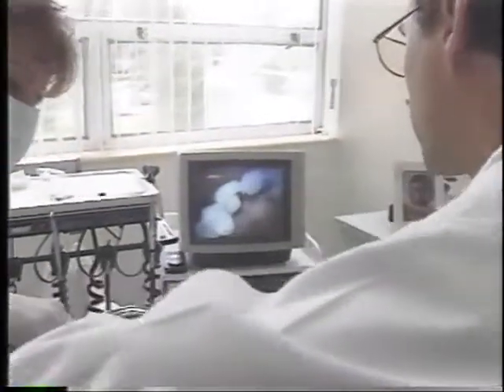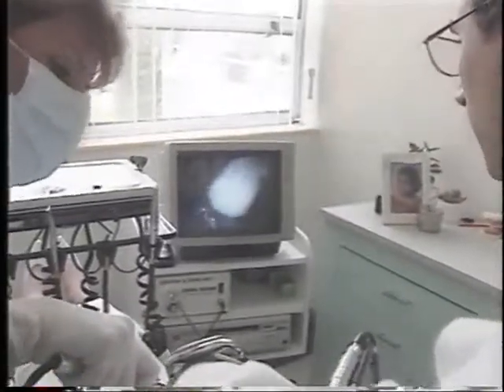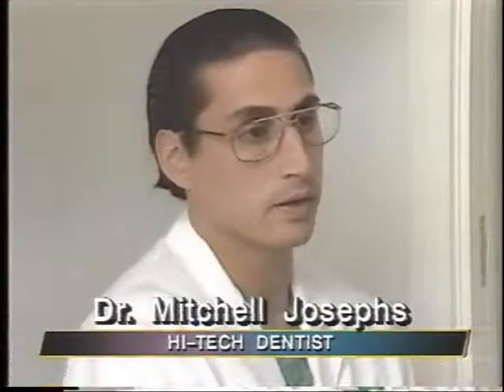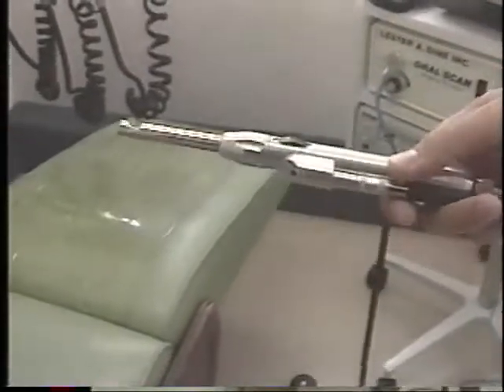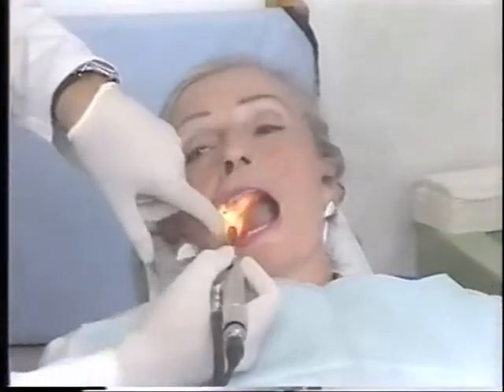Ann Martin is in for a routine checkup. Her teeth and gums are magnified 15 times as the dentist and patient can see inside her mouth simultaneously. This really enhances pathology, faulty fillings in the mouth. The fiber optic light shines through the tooth and literally lights up the whole tooth. You could see fracture lines, you could see decay that's going on underneath old fillings. The camera looks like a fat stainless steel pen. Doctors say it's easier to maneuver than a scalpel and picks up where x-rays leave off.